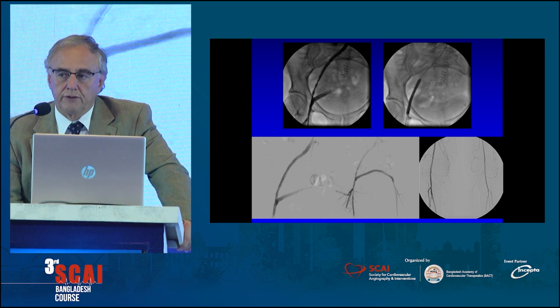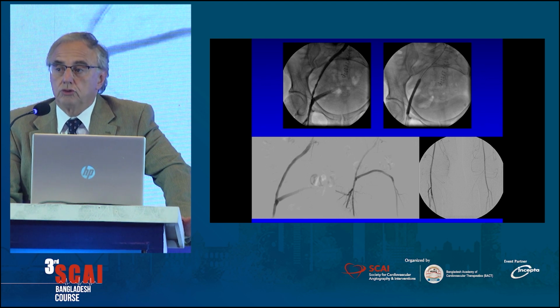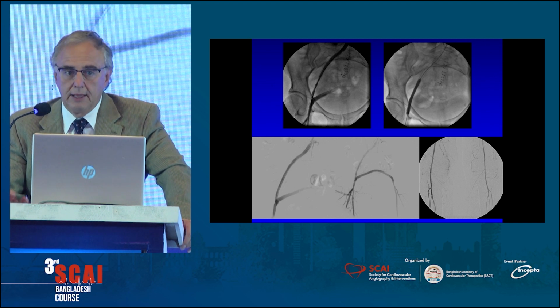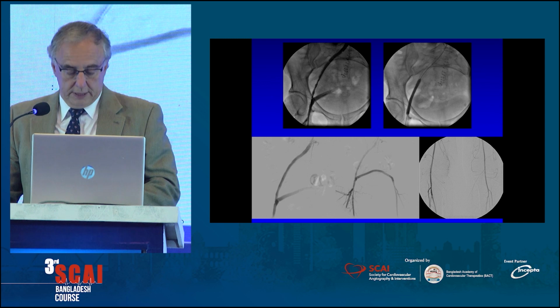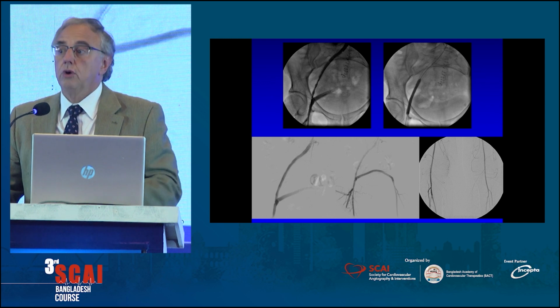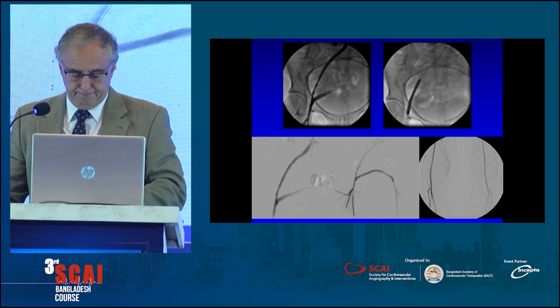So this is a very interesting case in the sense that it was an acute occlusion of the stent that produced complete occlusion of both legs at the same time. If you recognize that, the treatment was the one that I showed you. Redo surgery would be a real challenging case.